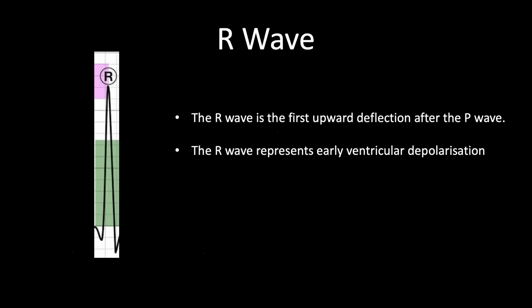This becomes particularly important when you're thinking about left ventricular hypertrophy, so enlarged hearts, and ischemia can affect this R wave progression, and there's lots of other conditions, but just to remember why the R wave is important.